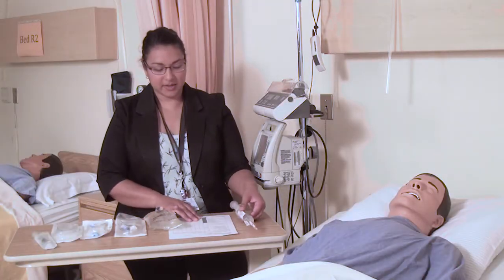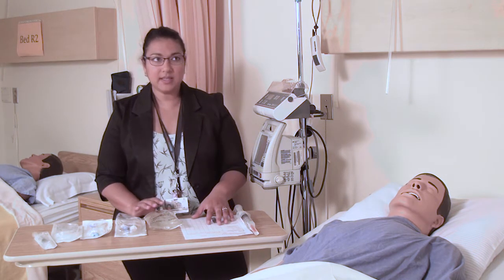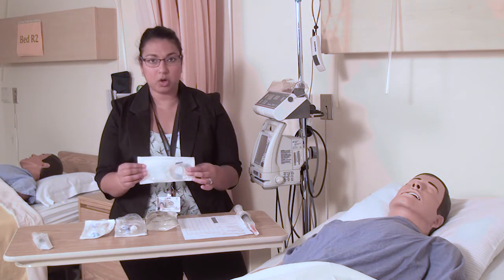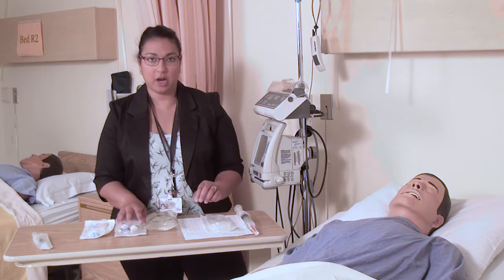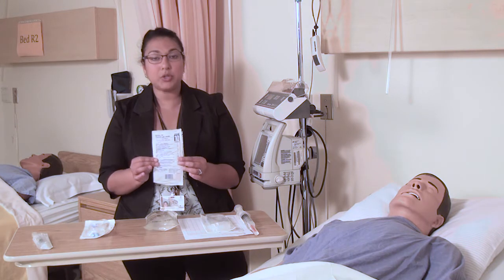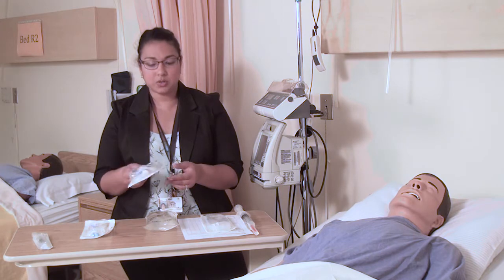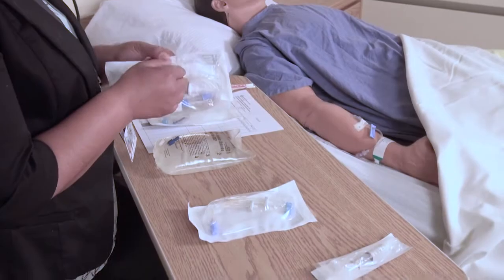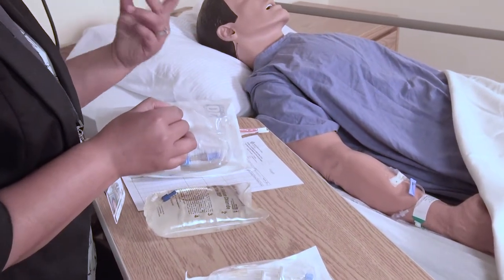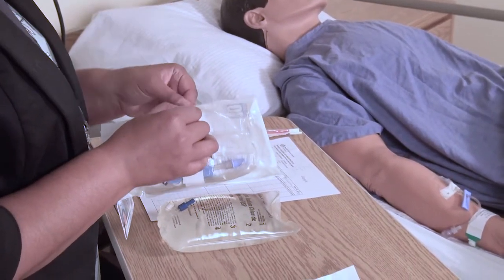Now we're at the patient's bedside and we're getting ready to hang our medication. Because the PCA is going through microtubing, which is very small tubing, you need to make sure that you have a carrier. It's very, very important that you correctly choose the solution set as opposed to your normal primary set. The reason is because the solution set has no ports. A port would allow someone to attach a medication and, let's say, give a push or do a secondary infusion on the PCA itself.